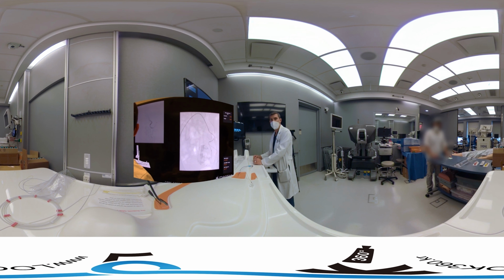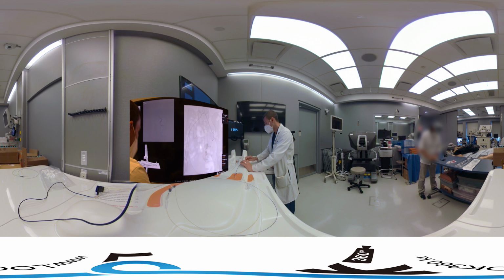Okay, so for this step, we're going to get the wire through the catheter, and again we have the Roberts uterine catheter here that we're going to use to form a loop to bring to the other side. So we're going to get this wire up to the midpoint, and then we're going to push and twist up, and that will form that loop in that catheter. And you can see it here. Let me follow this so you can see it.